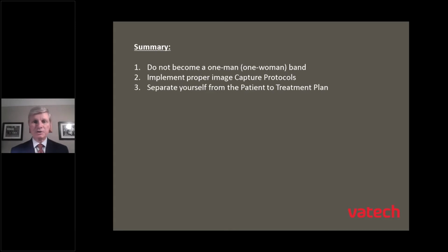Evaluate the scan in your private office, where you can verify, number one, again, that you captured the region of interest. Number two, you verify the patient was stable during image capture, so you have good quality scans to work with. Okay, and if you have the ability to, certainly treatment plan.